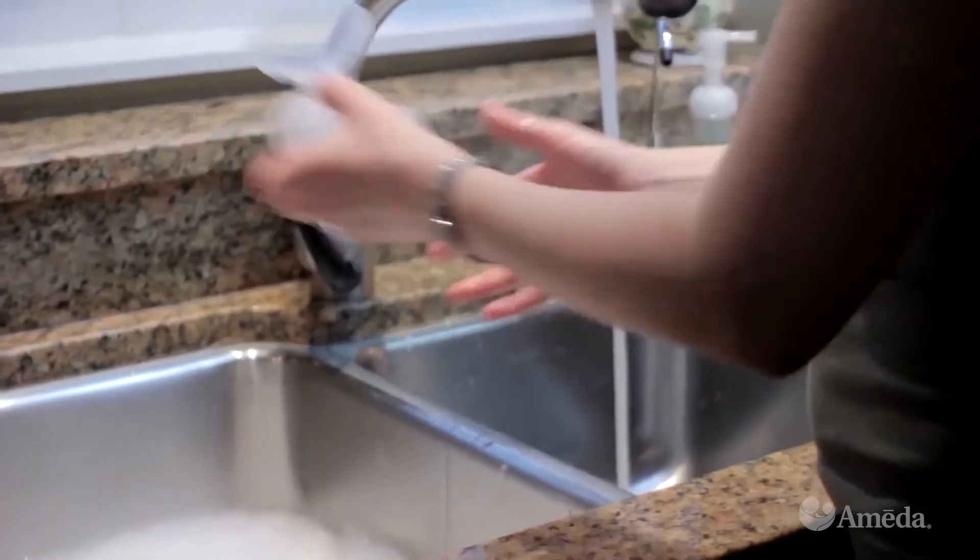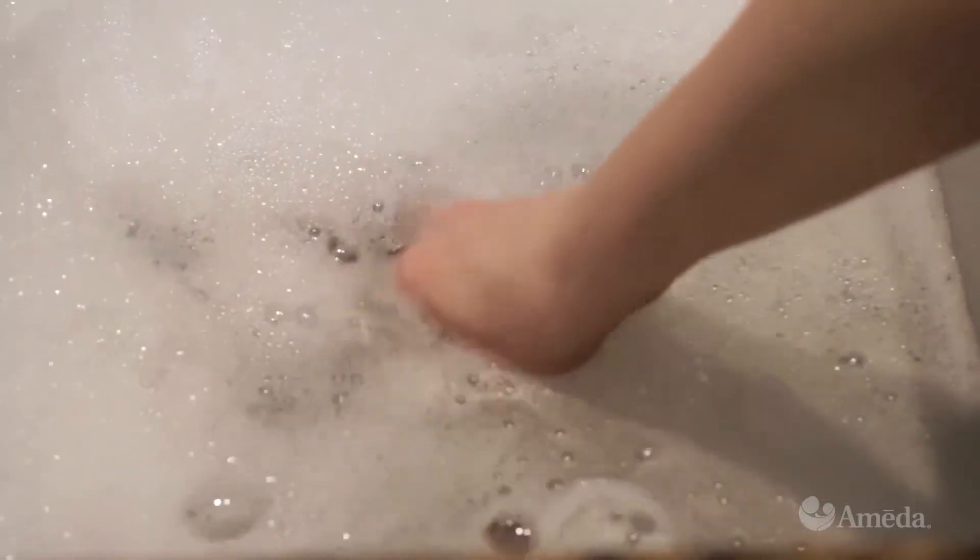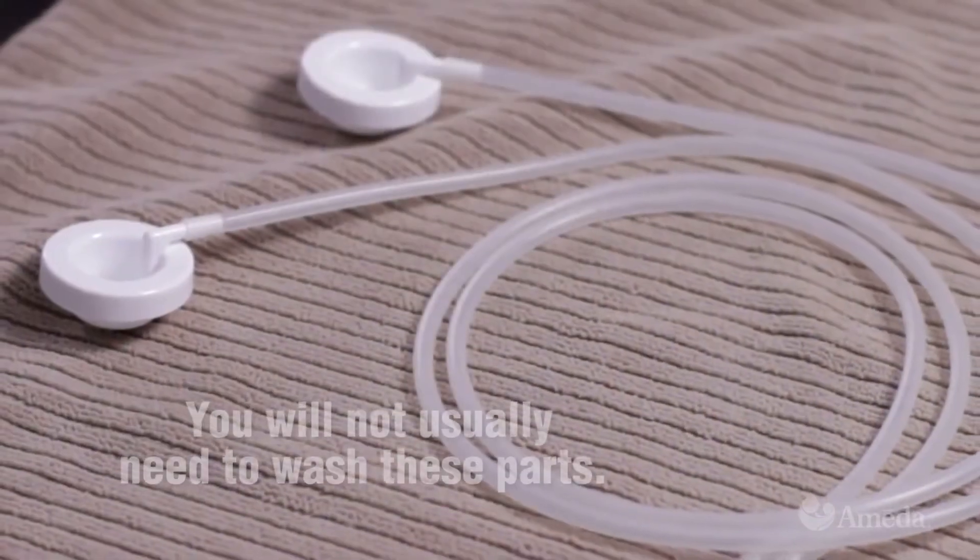All parts of the Hygiena Kit that come in contact with your milk should be rinsed with cool water and then washed well in warm, soapy water.